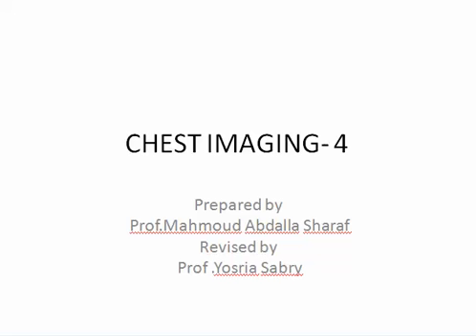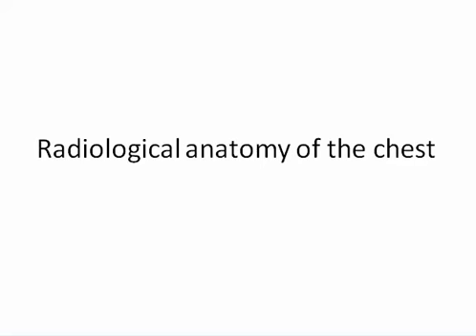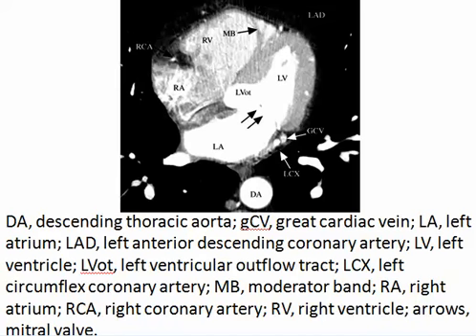Presentation Chest Imaging 4, prepared by Prof. Sharaf and revised by Prof. Yusra Sabri. Again, still we have to talk about radiological anatomy of the chest and heart.